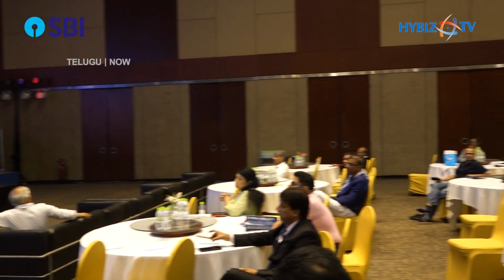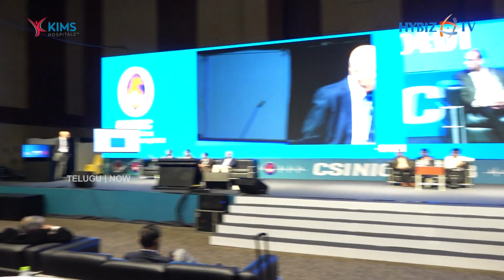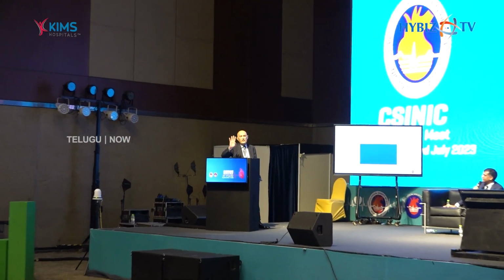Dr. Manoj, followed by Dr. Sharma from the audience. Professor Imad Sheiban, it's wonderful listening to you. My question is, we all know here that the angiographic assessment of any vessel has its own limitation. So after a provisional stenting, would you just be happy with the flow angiographically to assess the major side branch like a circumflex, or would you consider, in the absence of side branch physiology, to just leave the stent alone in the left main to LAD? So angiography alone, you are happy for the side branch assessment, or do you want something else? No, I'm happy to leave it. If there is no compromise there, I'm happy to leave it.